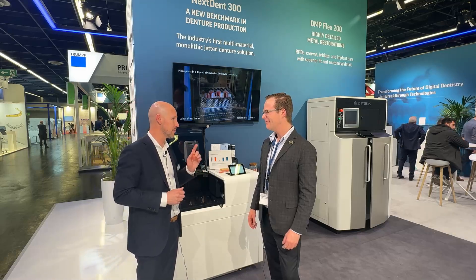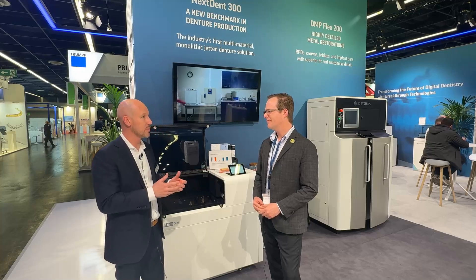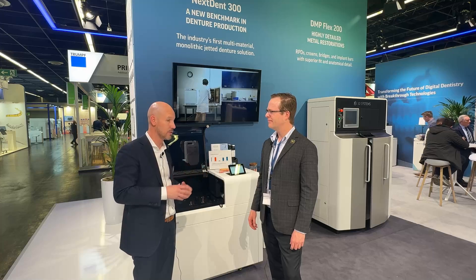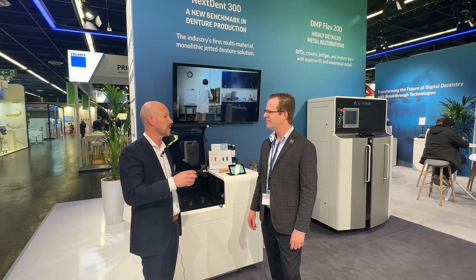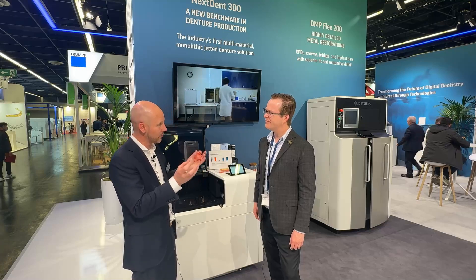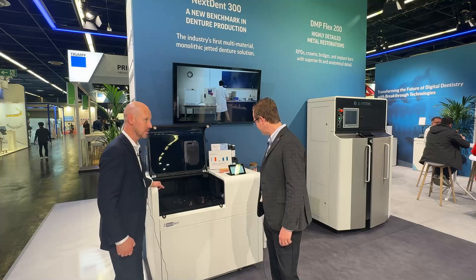Now it is important that both materials were developed with that specific intended use in mind. The base material is optimized for impact strength and everything that a base needs to be optimized for. And the teeth are hard, wear-resistant, a nice shade, translucency. It's very difficult to combine two different materials in one print process, and that's where multi-jet actually brings the solution.